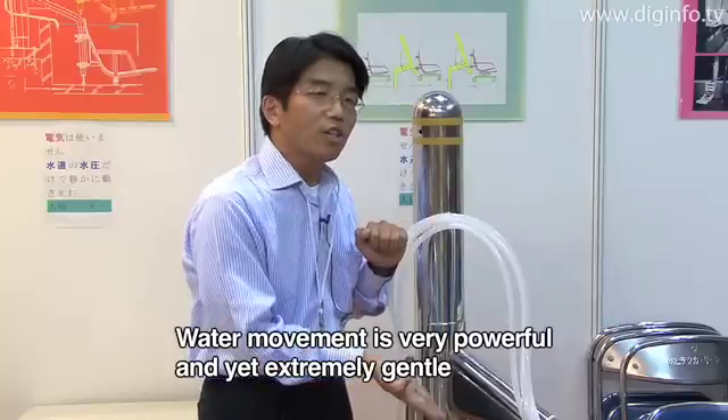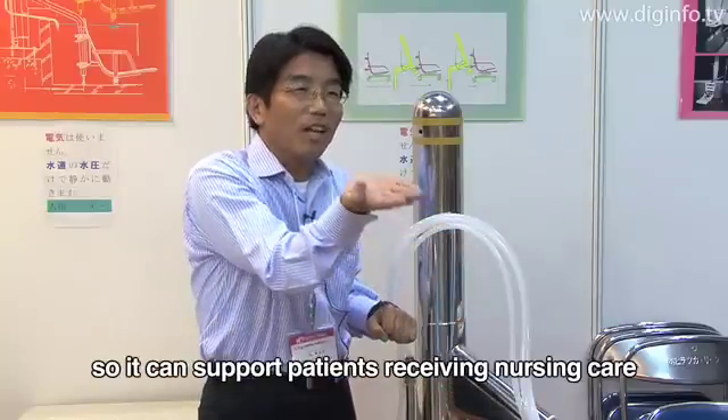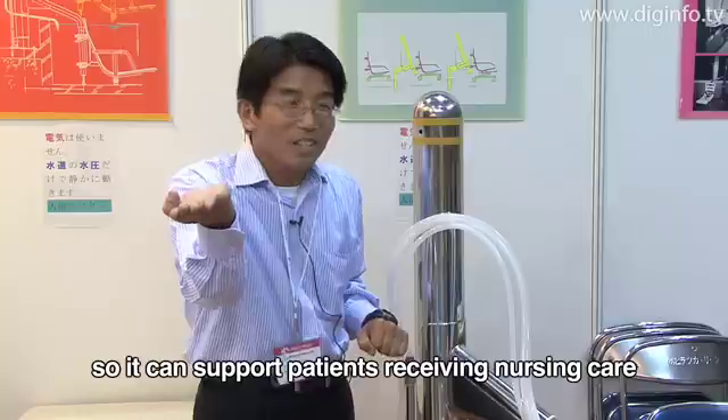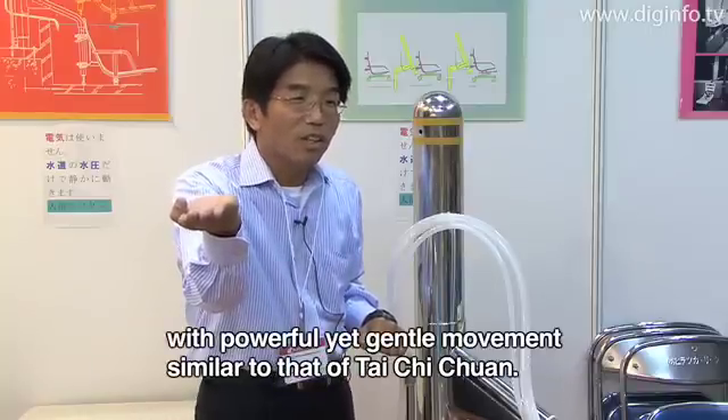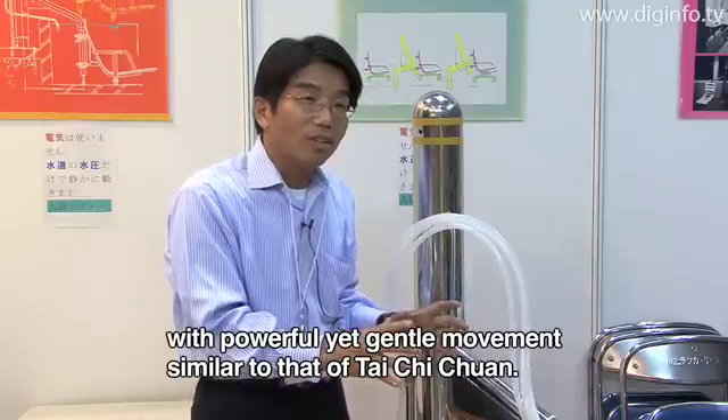The water movement is very powerful and very gentle — like a smooth, gentle motion — so it can support patients with the care of a support specialist.